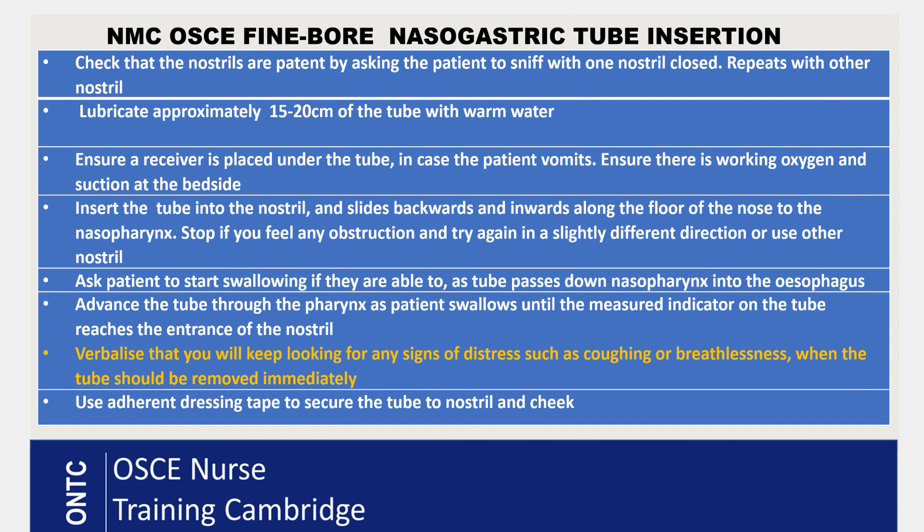While inserting the tube into the mannequin, continuously verbalize that you are observing the patient for any signs of distress such as coughing or breathlessness. If these occur, you would remove the tube immediately. Once the tube reaches the measurement mark, stop. Use adherent tape to fix the tube to the nostril, and add a little tape to the cheek to keep it in place.